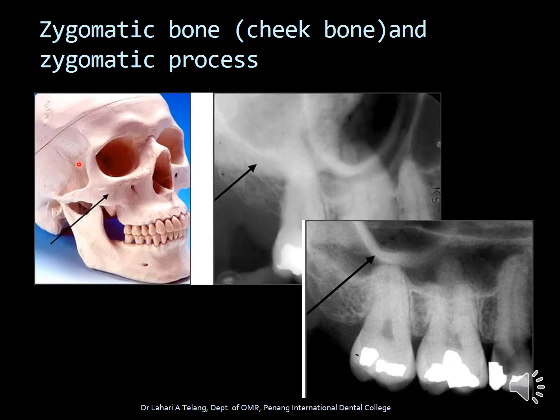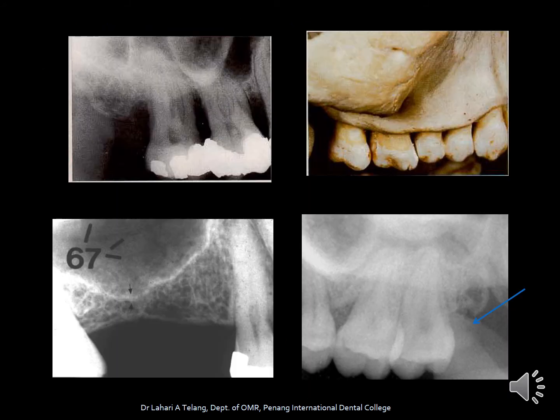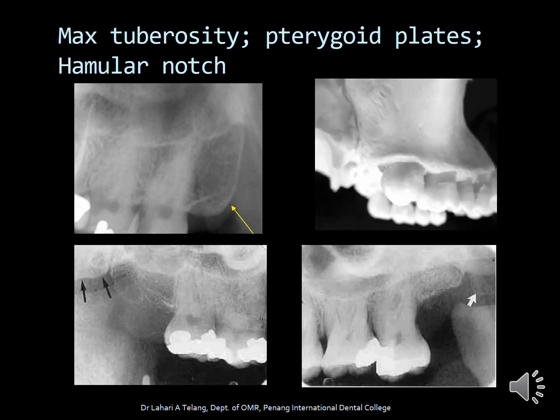The zygomatic bone is the cheek bone, visible as a radiopaque shadow on posterior maxillary radiographs, along with the U-shaped shadow which is the zygomatic process. Additional images further demonstrate the zygomatic process, the floor of the maxillary sinus dipping quite low in an edentulous area. The maxillary tuberosity is the end of the maxilla, indicated by the yellow arrow mark. The pterygoid plates are indicated by the black and white arrow marks, along with the notch-like area called the hamular notch.